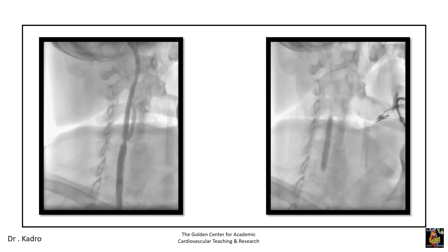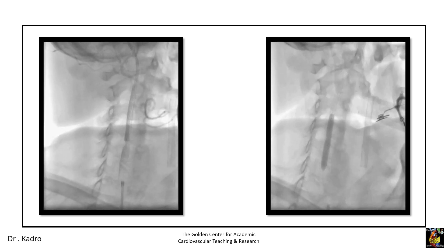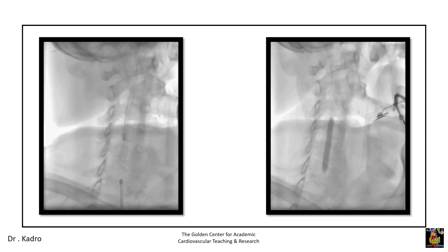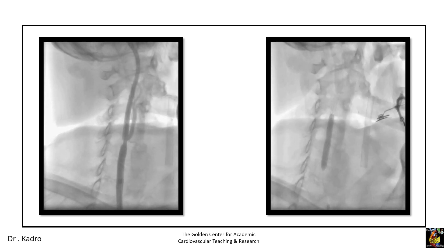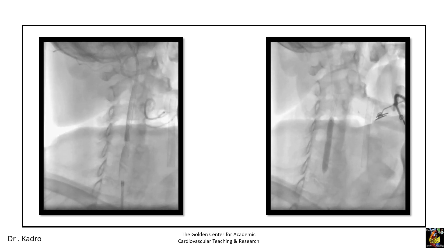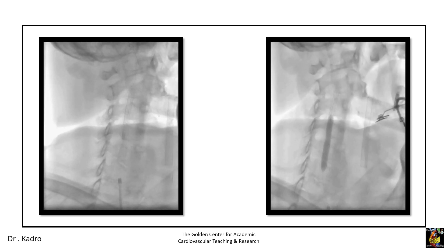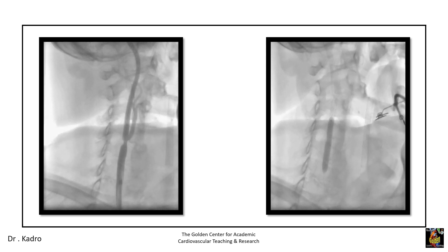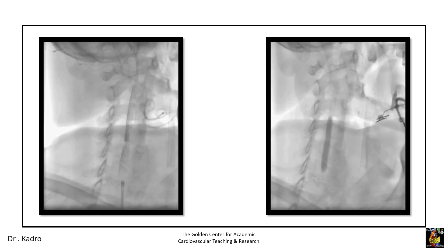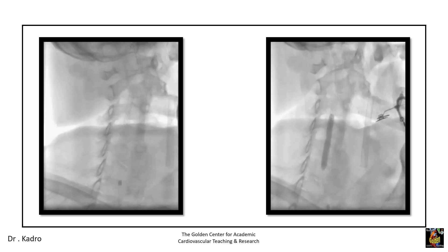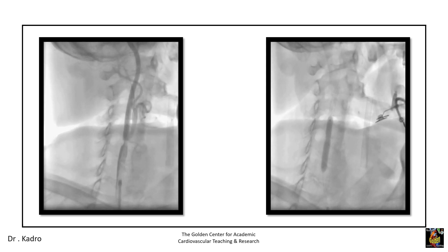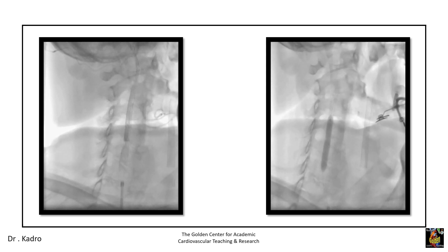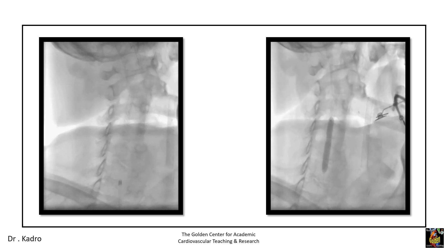The angiogram after stenting shows residual stenosis requiring post-dilation. Post-dilation was performed with a 5.5 mm balloon, and you can see there is still some denting at the lesion due to heavy calcification.